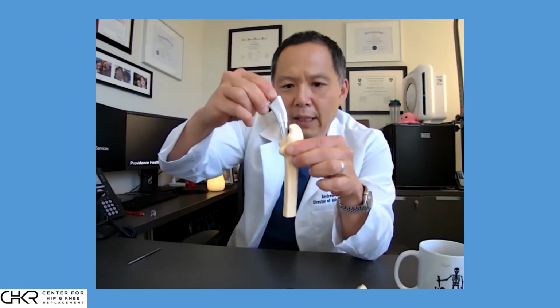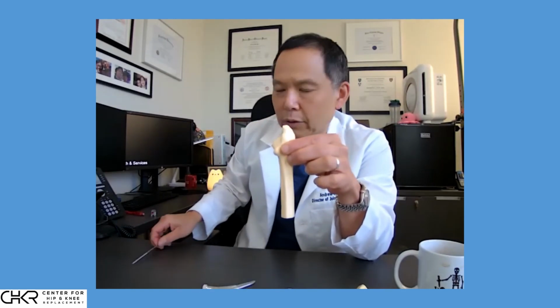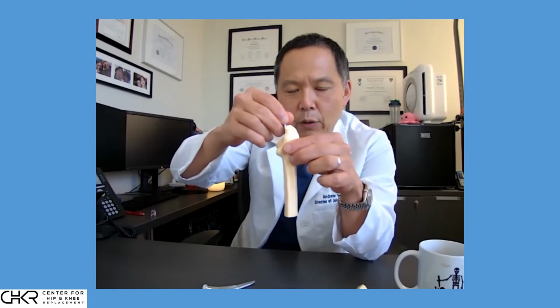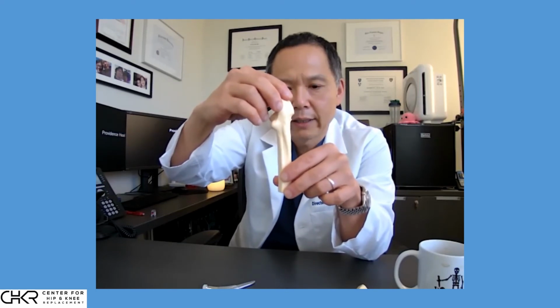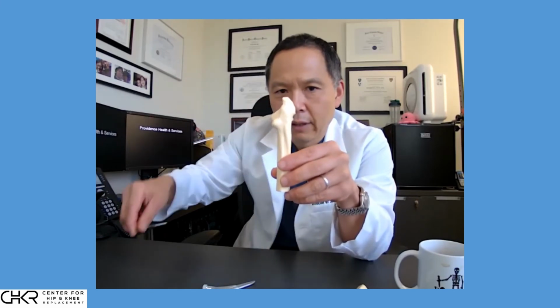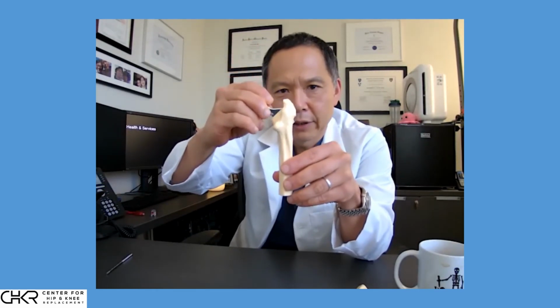And so what we'll do is we'll remove the femoral head, which then exposes this canal. And deep within this canal is the obstacle. The problem is that obstacle blocks this stem from going in. It'll stop here. And so what we'll need to do is we'll need to take special tools that allow us to drill past that hole. And when we do that, we'll then look at the x-ray in two planes to make sure that we are drilling down the hole and not outside the cortex of the bone. Once we drill past that and clean up the canal, then we will have created a safe pathway for the stem to fully enter.